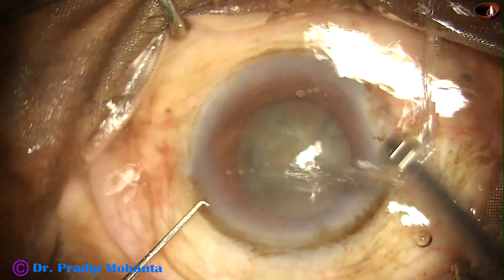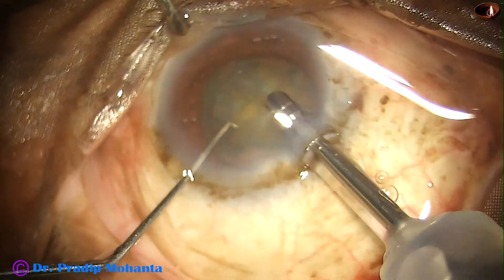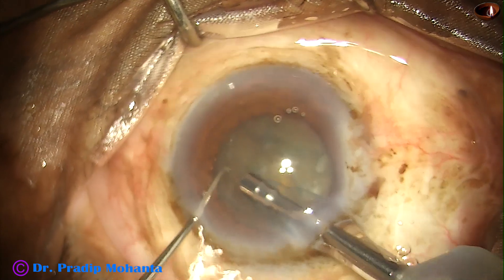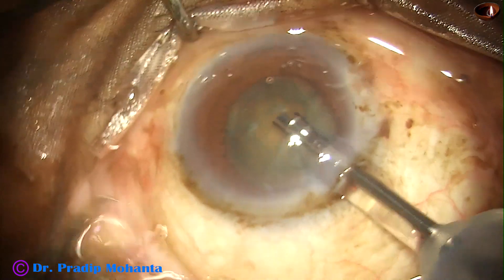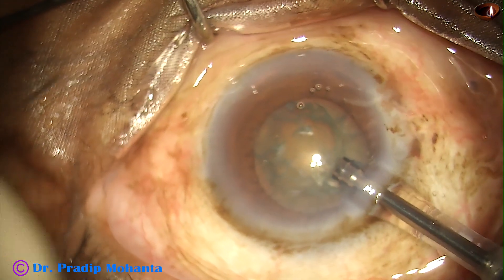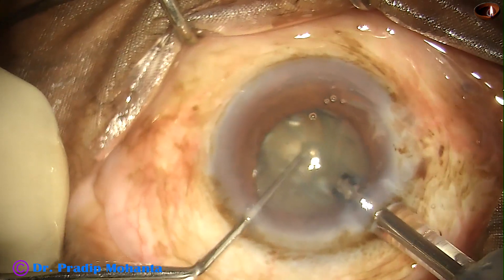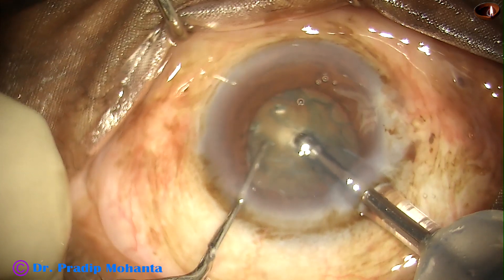And now the phaco tip is being introduced into the anterior chamber. This is the cobra tip of Galaxy Lio phaco machine from Appa Sameh Associates. I like this kind of phaco tip — when the shaft is narrower than the tip, the incidence of wound burn is much less.